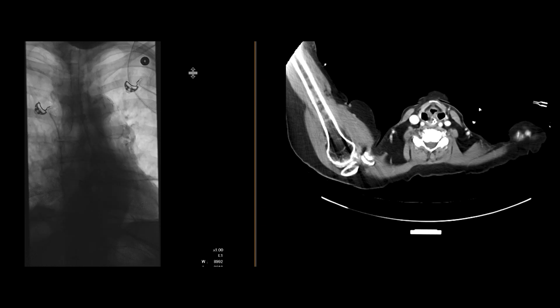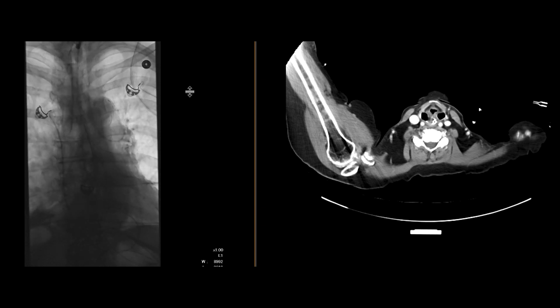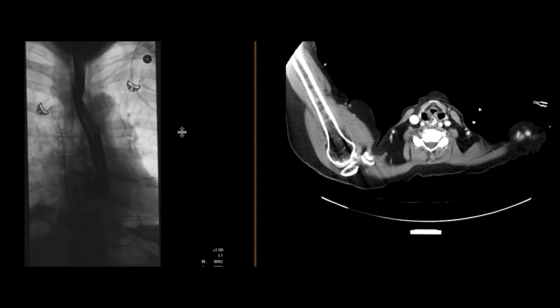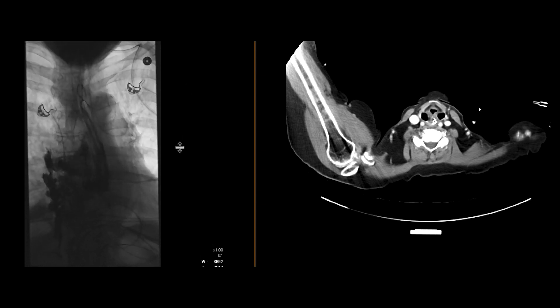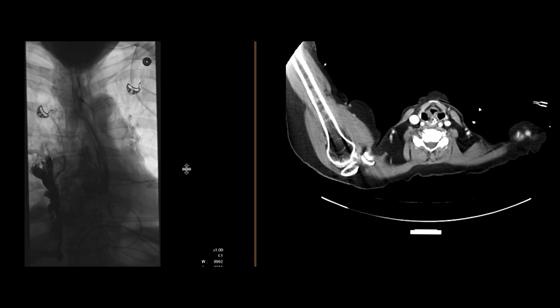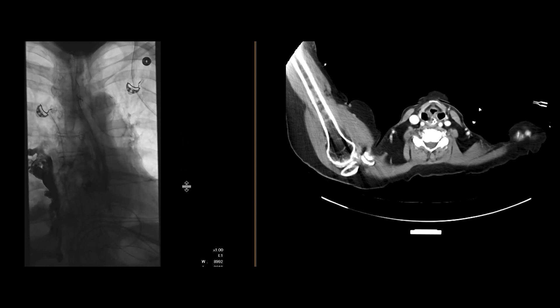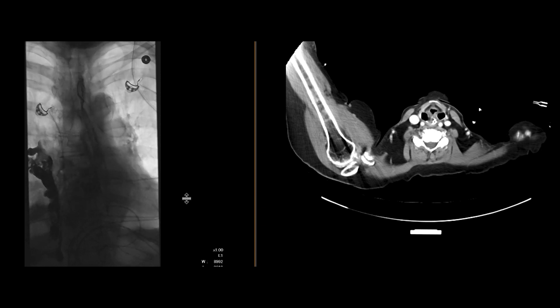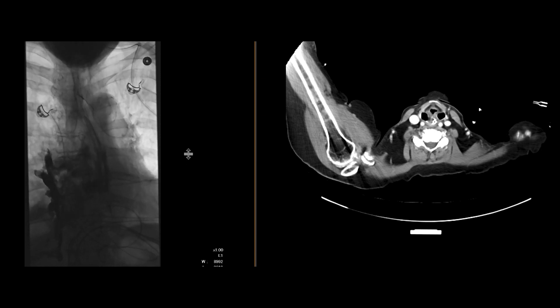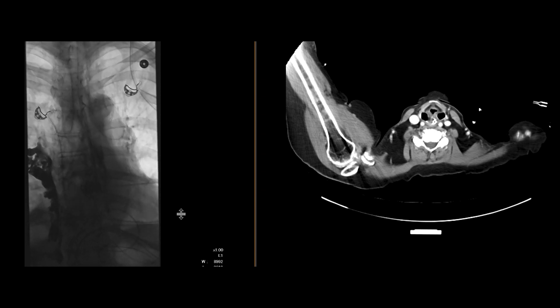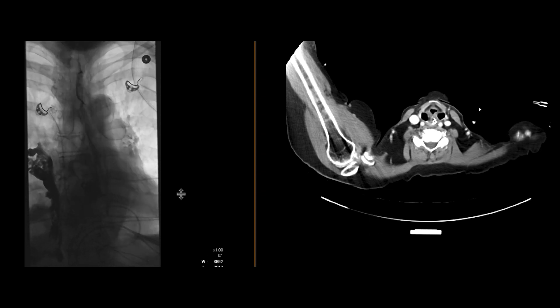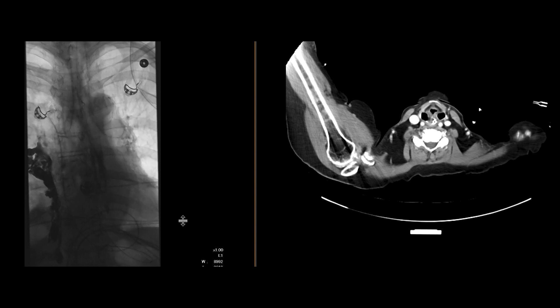After giving water-soluble contrast, you can see there is quite extensive extravasation of contrast from the distal esophagus towards the right side of the thoracic cavity, and essentially all of it is just leaking out into that space, with nothing really going more distally into the stomach.